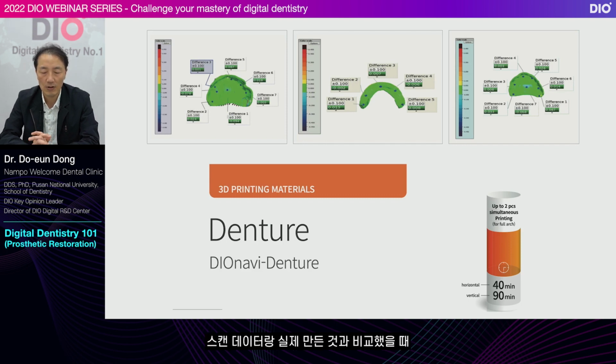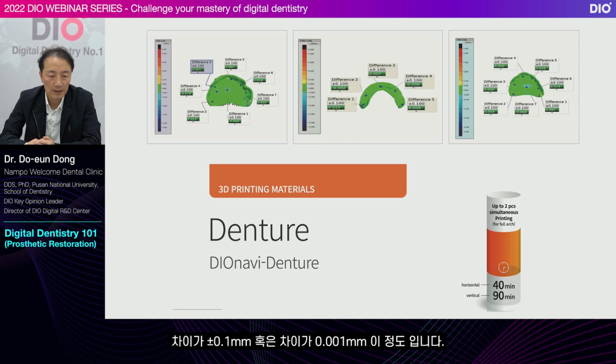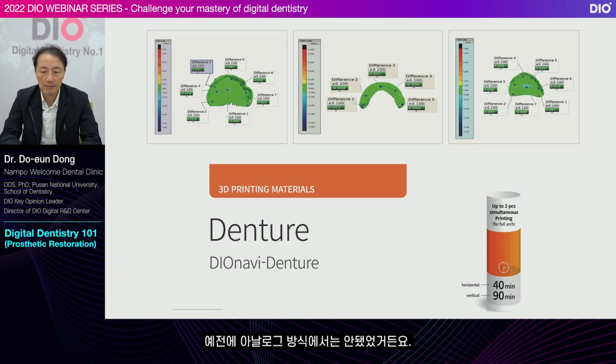When comparing the scanned data and the actual product, the green color shows that there is almost no error. The difference is plus or minus 0.1 millimeters, or about 0.001 millimeters. It comes out like this. It's almost the same as the copy. This is the biggest advantage of digital dentures. This kind of work was not possible using the analog method.